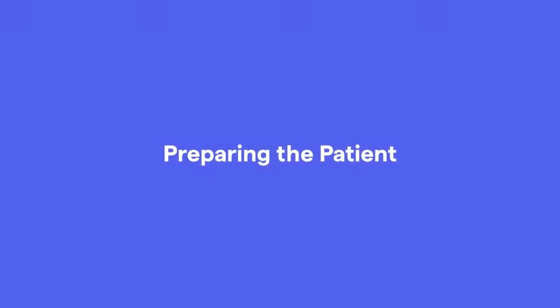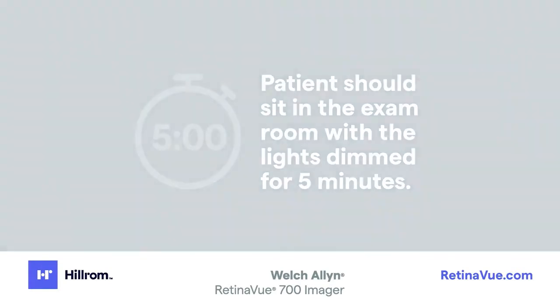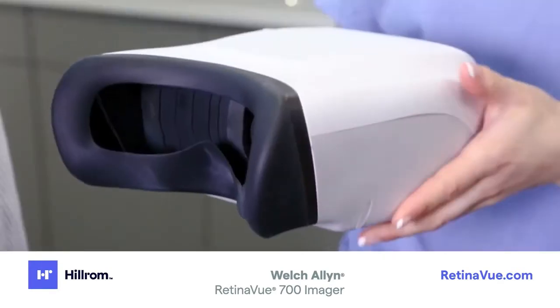Preparing the patient. Before administering the exam, patients should sit in the exam room with the lights dimmed for five minutes to allow their pupils to dilate naturally. Let them feel the face cup.